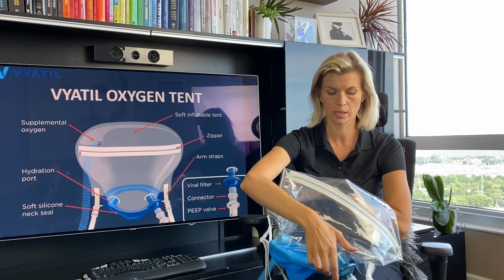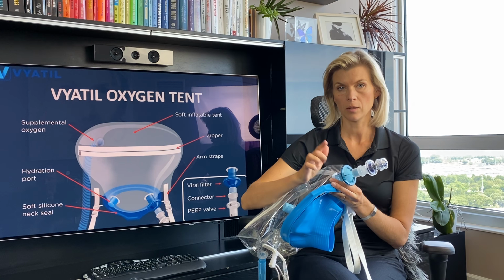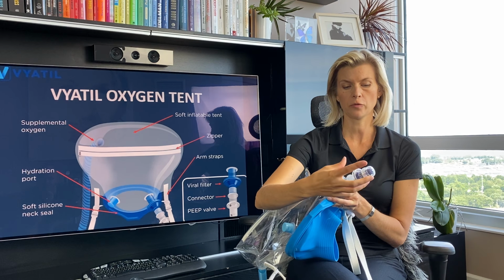And this is our exit port. So you want to make sure you use the viral and bacterial filter. There is a connector for the PEEP valve.